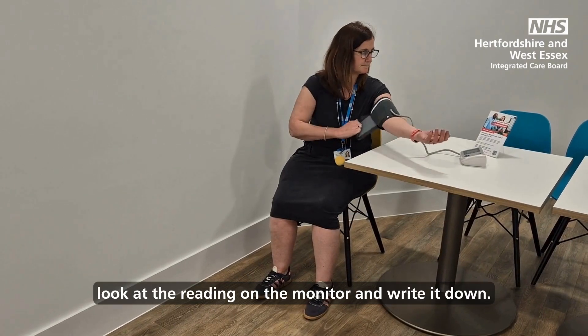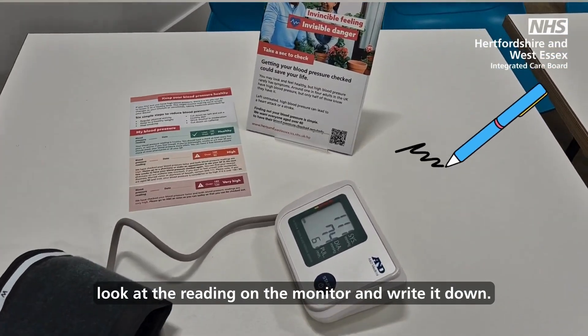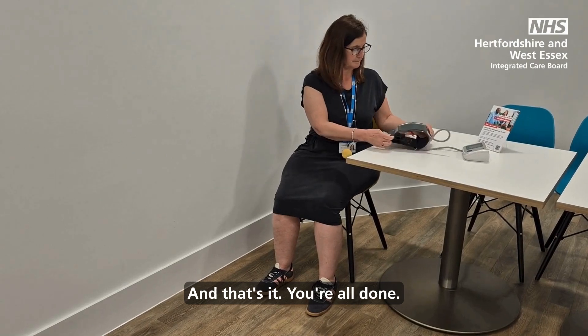Try to stay still and quiet while the reading is taking place. Once the cuff is released, look at the reading on the monitor and write it down. And that's it — you're all done.